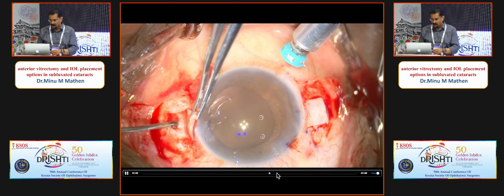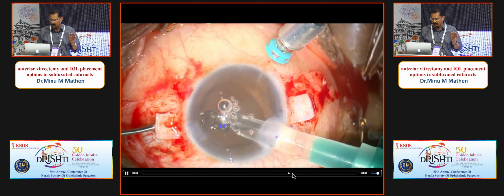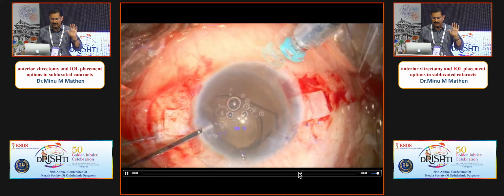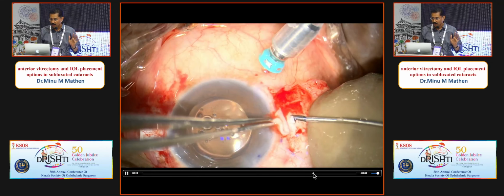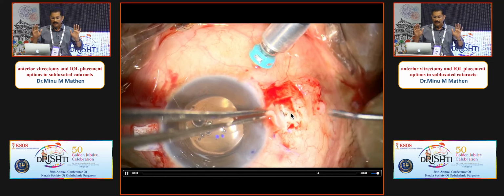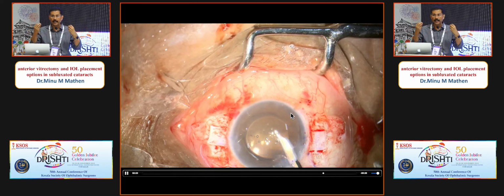So once it is held and pulled, you can notice that it gently comes out, and once it is out, it just sits there. See that? It just sits there. You can leave it there. No more tucking, nothing. And the other side also, hold it and bring it out, leave it, and that's it. It remains flat. It closes the sclerotomy opening. That's very, very important. It doesn't leak at all.